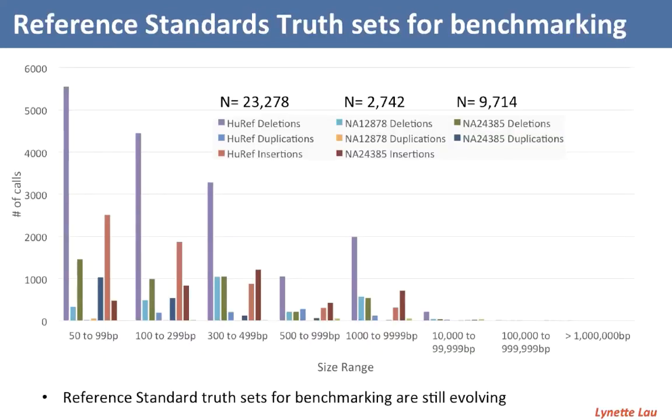And the one thing I also did want to mention was that reference standards, I think for the single nucleotide and the smaller variants, are very good right now. But I think for CNVs, there's still a lot of work to be done, and they are very much evolving.